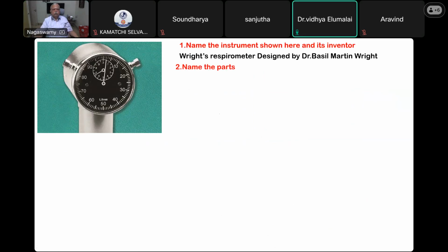It has 2 values, sir. One is in liters and... So you have a dial which is marked with a inside there is a smaller circle, outside there is a bigger circle. Okay, and it is written liters here. So the outer circle is divided into 10, 15, 20, 25 like that, in larger numbers of liters. And there is a pointer for that. And the inner circle is marked in 0.1, 0.2. That means 100 ml, 200 ml, up to a maximum of 1 liter.